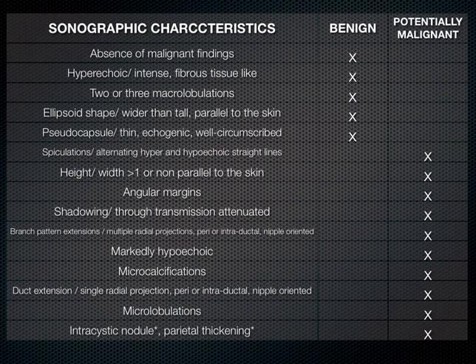Not to burden you with a detailed slide, but if you are interested, you can go back and review some of these signs, the characteristics that make certain masses benign and other masses more malignant on ultrasound. These are all ultrasound findings here.